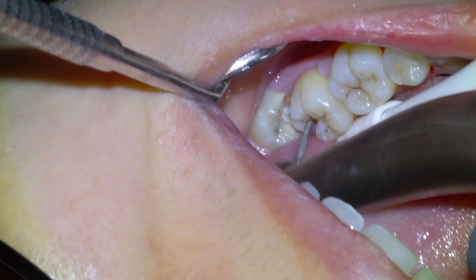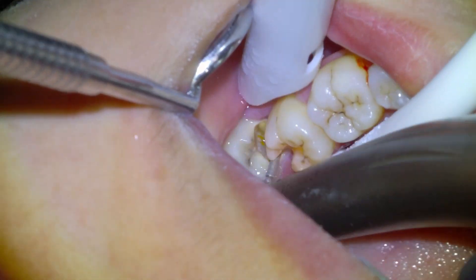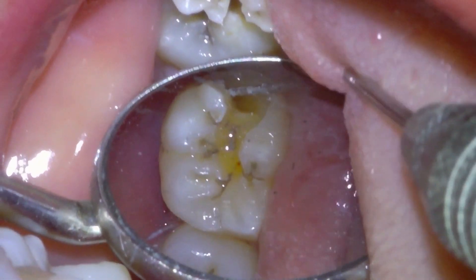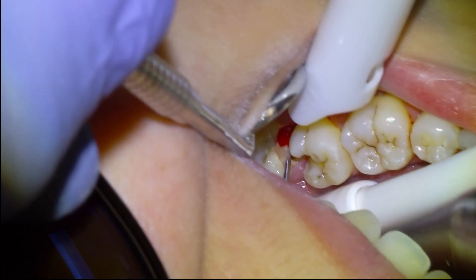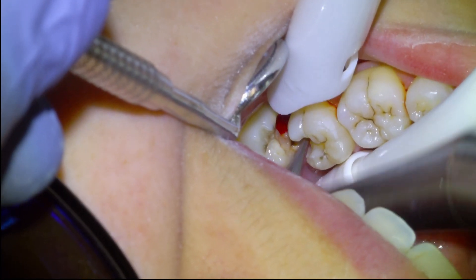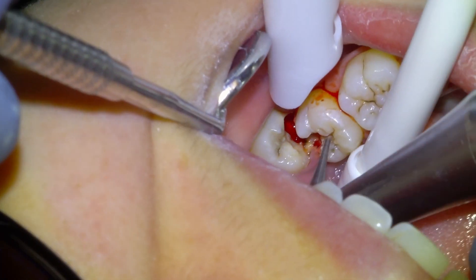This tooth actually tested vital to EPT and cold without lingering pain, so we had a fairly favorable prognosis. You can see there's still some decay on the buccal surface — the explorer just dives right in — so we're going to continue removing the soft tooth decay with a small round carbide burr.